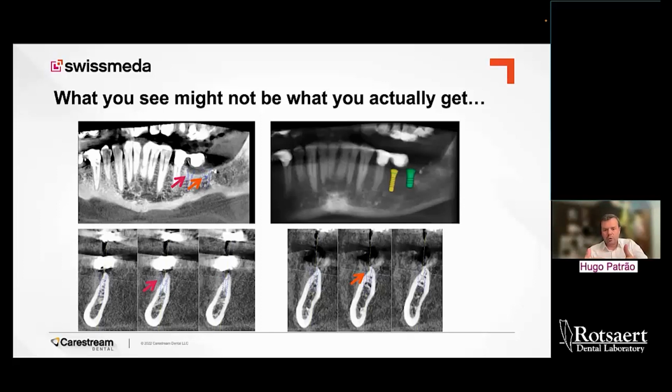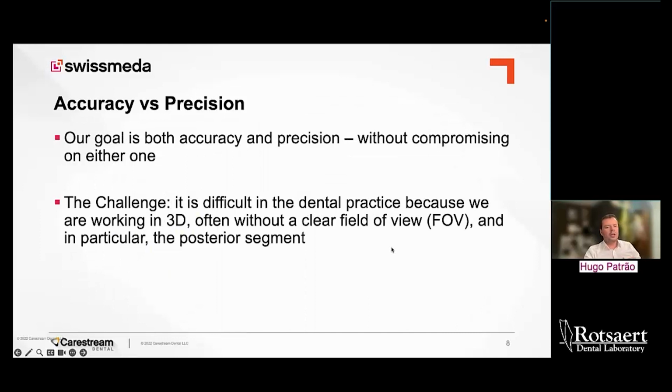And this is exactly what we're talking about today: the issues will happen, but you are prepared for any kind of issues or problems that may arise during the surgery. With guided surgery, we move from what is well known in Europe as reactive surgery to a more predictable, controlled surgery, because you don't need to react along the surgery.